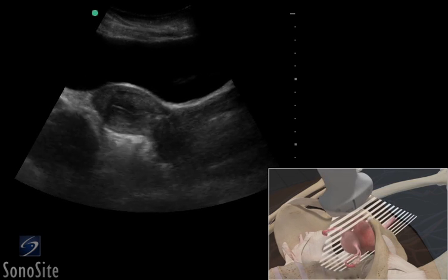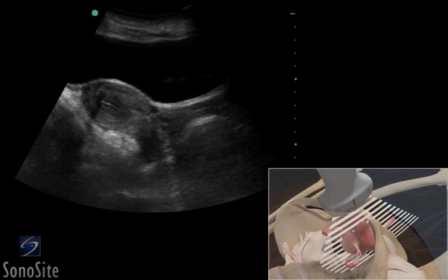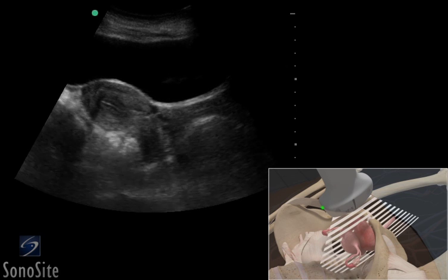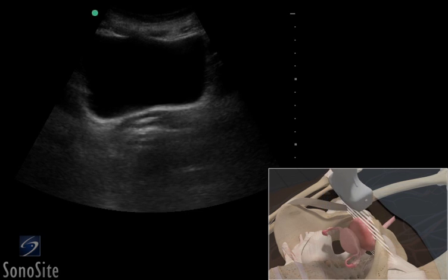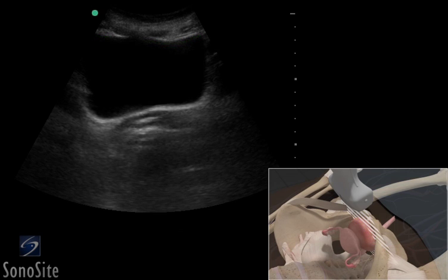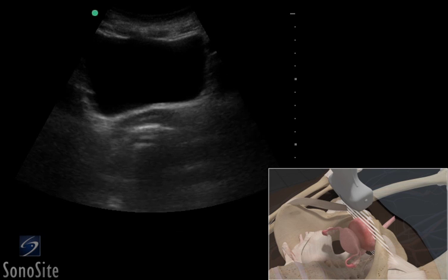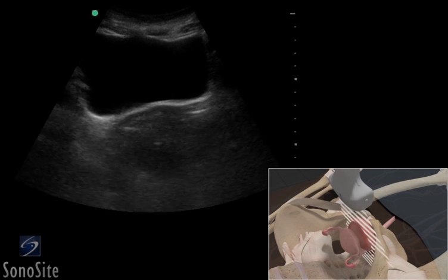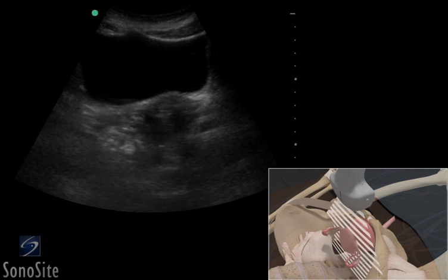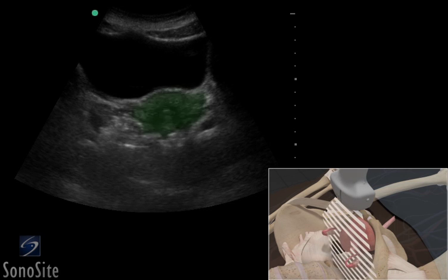To obtain a transverse view of the uterus, rotate the transducer 90 degrees so the orientation marker is to the patient's right. The bladder appears more rectangular in shape in this view. Sweep the transducer superiorly from the level of the cervix to the fundus to see the entire uterus.